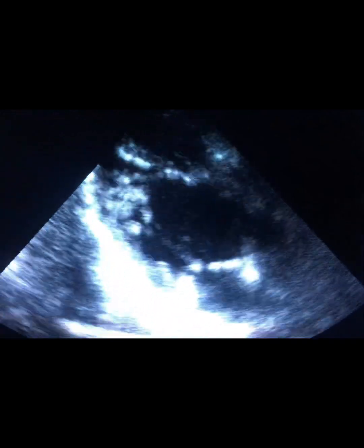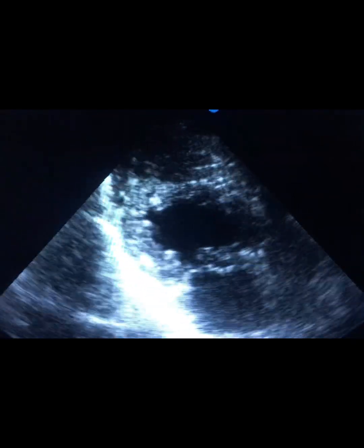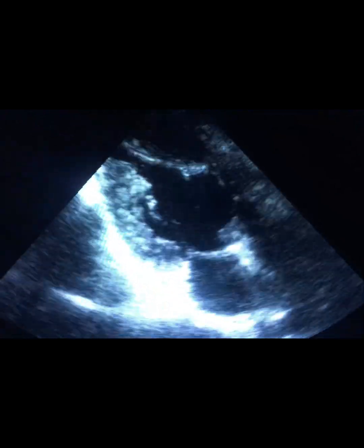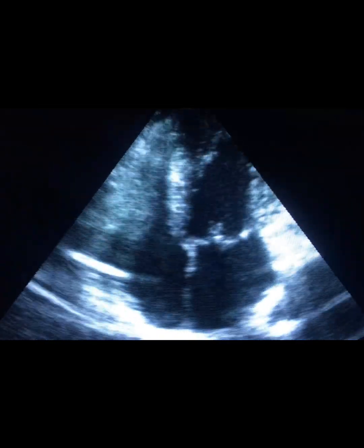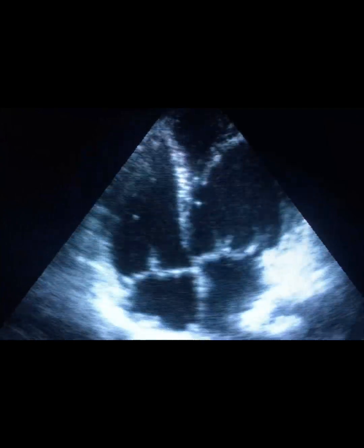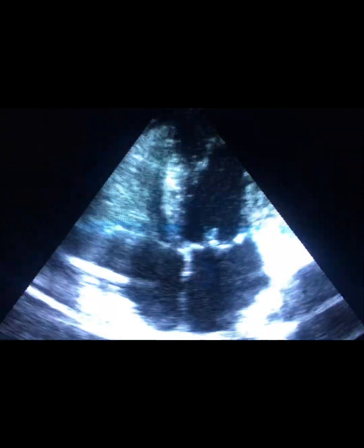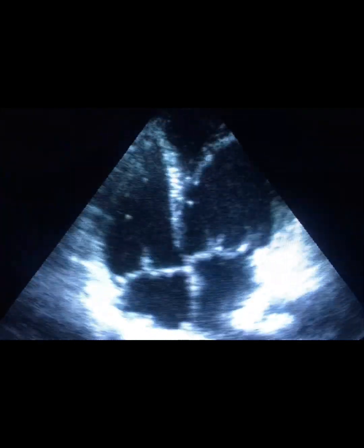Look at this view — a highly trabeculated ventricle. And this one: a prominent band in the left-side ventricle.